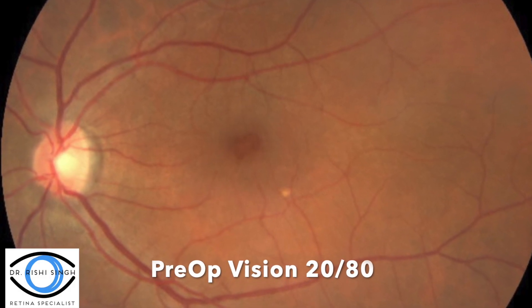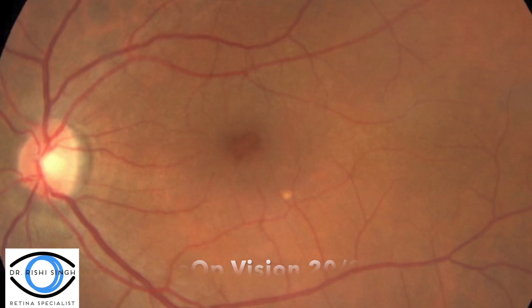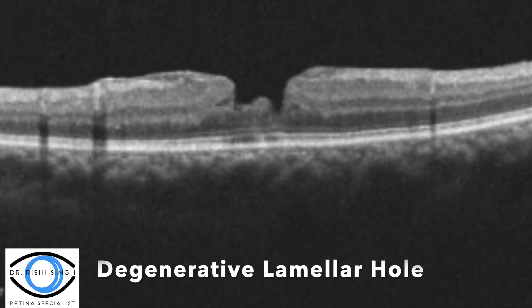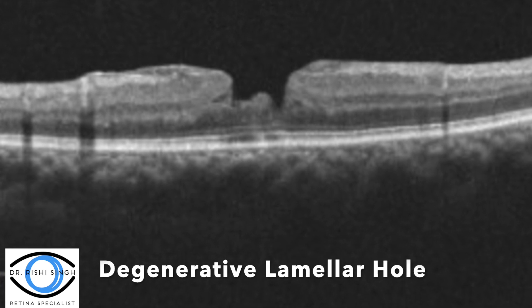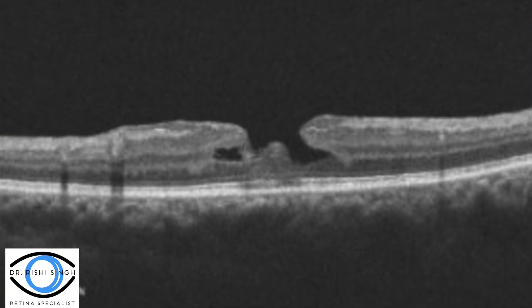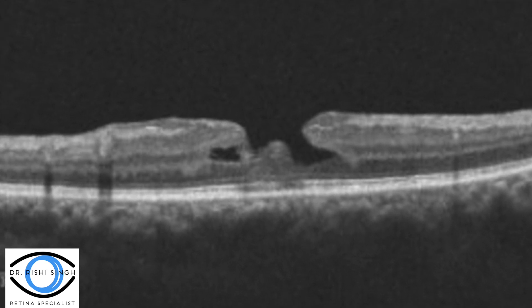This is a case of a lamellar macular hole with preoperative visual acuity of 20/80. The OCT demonstrates the typical degenerative lamellar hole appearance with lamellar hole-associated epiretinal proliferation as well as a top hat appearance.